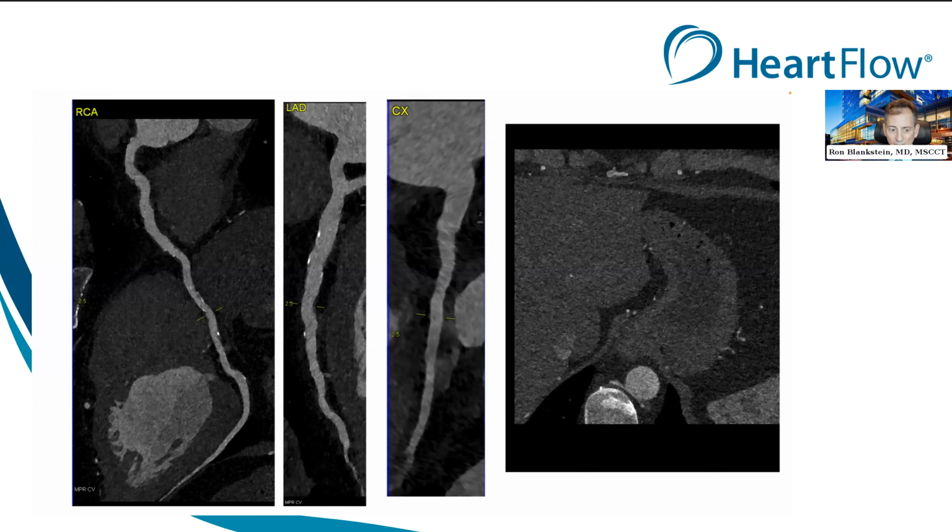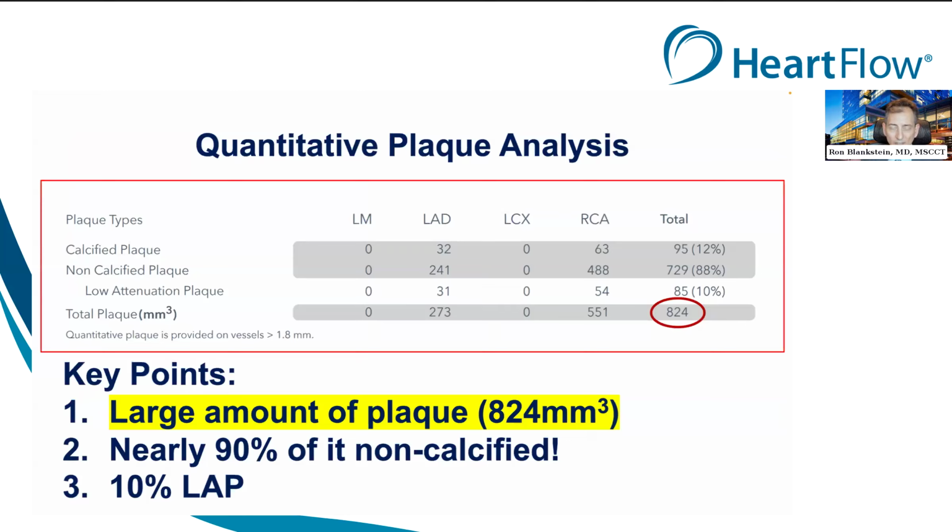But in this case, initially, we thought he had plaque. I don't think we were as impressed by the amount until we actually did a quantitative plaque analysis, and this was done by the HeartFlow tool that we're discussing today.